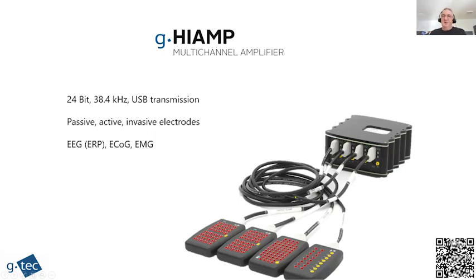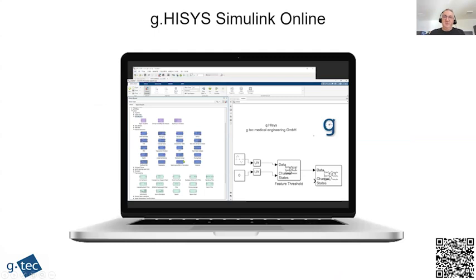In our case, we are using our g.tec amplifier, which has the maximum resolution of almost 40 kilohertz, and that can be used with 40 channels, or 20 kilohertz and 64 channels. It's a 24-bit amplifier, so the information is at 22 bits. And we can use it with passive, active, and invasive electrodes. There are actually some studies done also with invasive EEG electrodes with TMS. And over here you have the link for our web page for more information.